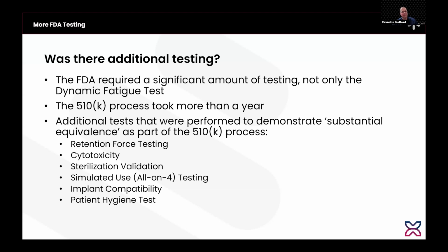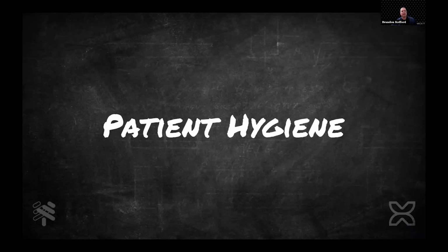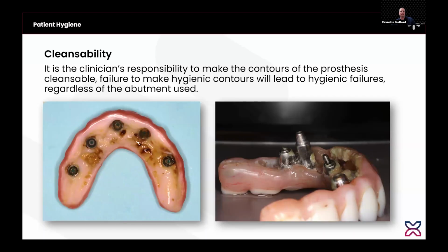And what was interesting was the FDA, there was a periodontist on the FDA panel who was really worried about the cleansability of the abutment. And at first I was like, what do you mean the cleansability of the abutment? And she specified, how is a patient going to clean this abutment? And I was flabbergasted. I was like, well, the same way you clean any abutment. So we had to do a patient hygiene test.